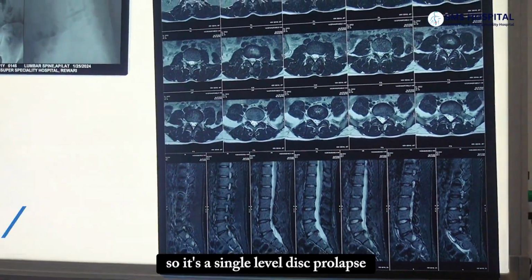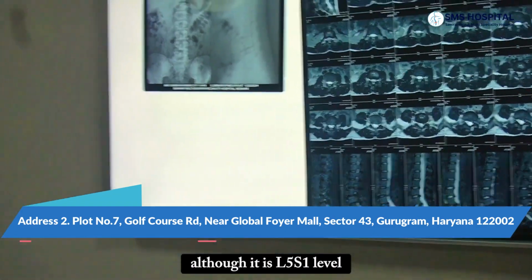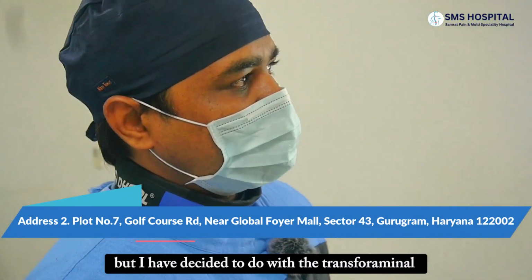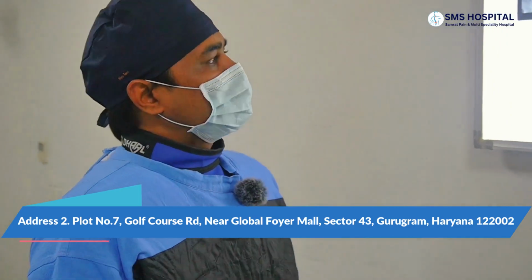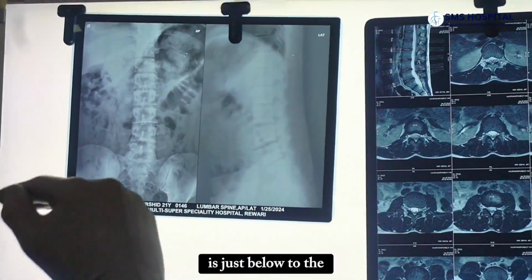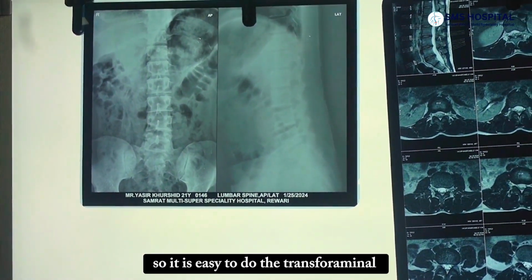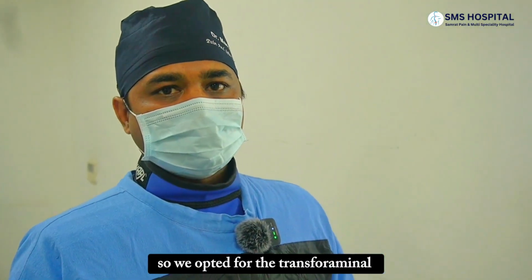So it's a single level disc prolapse. Although it is L5S1 level, I have decided to do it with the transforaminal approach because the height of the iliac crest is just below the pedicular line, so it is easy to do the transforaminal, so we opted for the transforaminal.